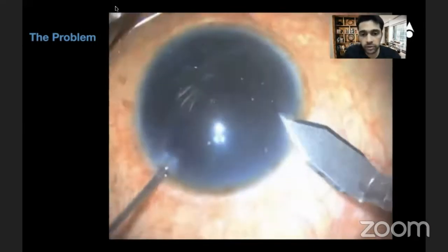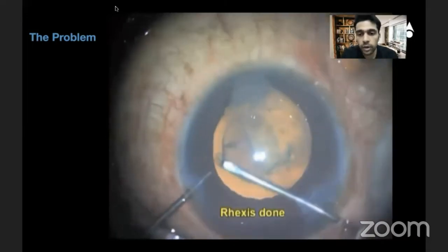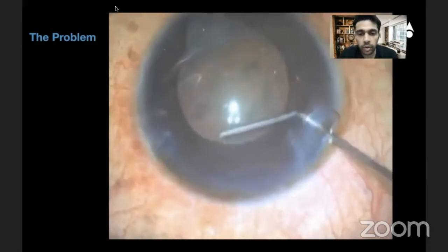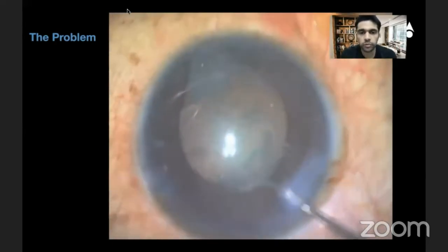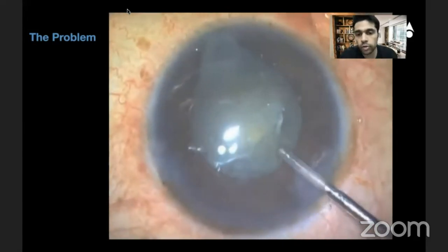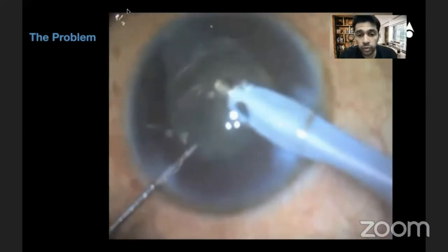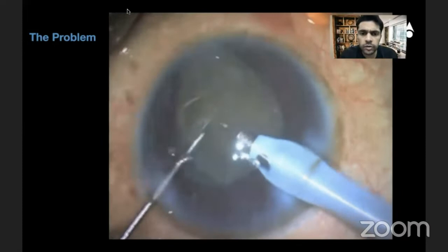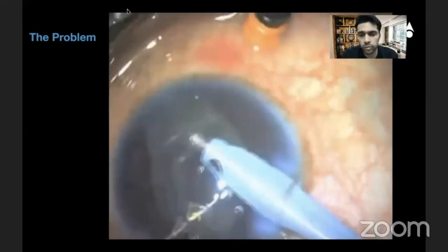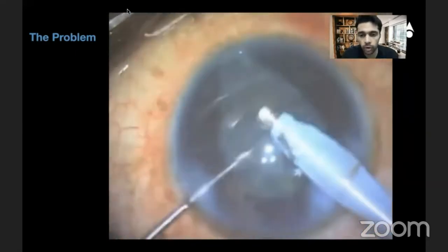This is a very simple small coloboma which could have been handled without any issues. Watch — I'm doing a simple hydrodissection at this point. It's absolutely fine. The amount of BSS applied is not too much and you can see the depth of the anterior chamber. As you prolong three to four minutes into FACO emulsification, this being a small pupil, you might have to be there a little bit longer.